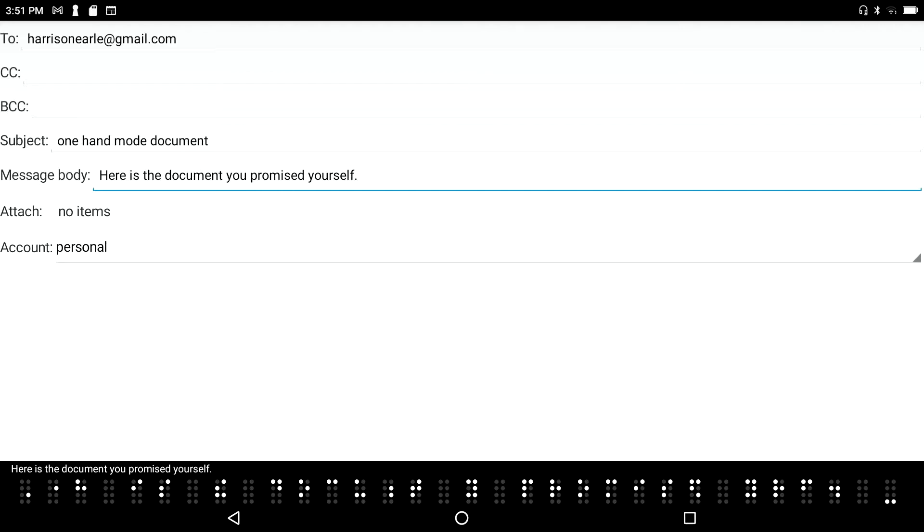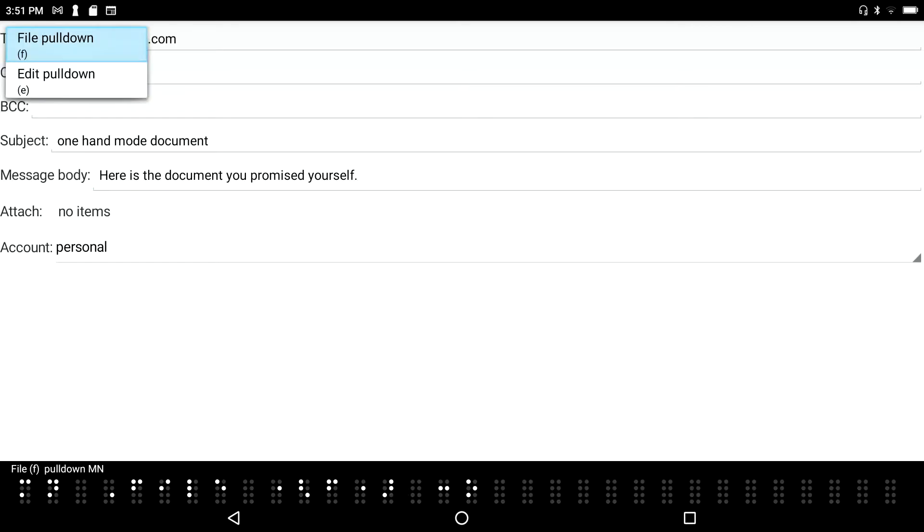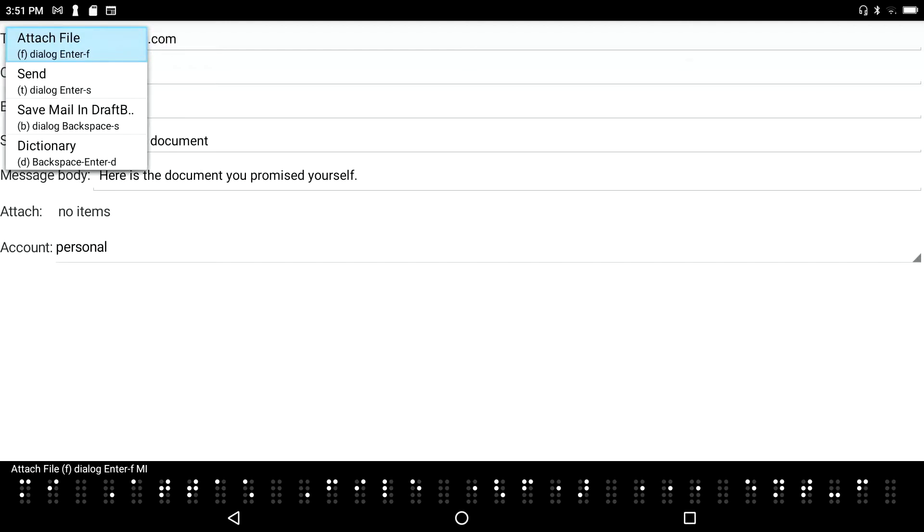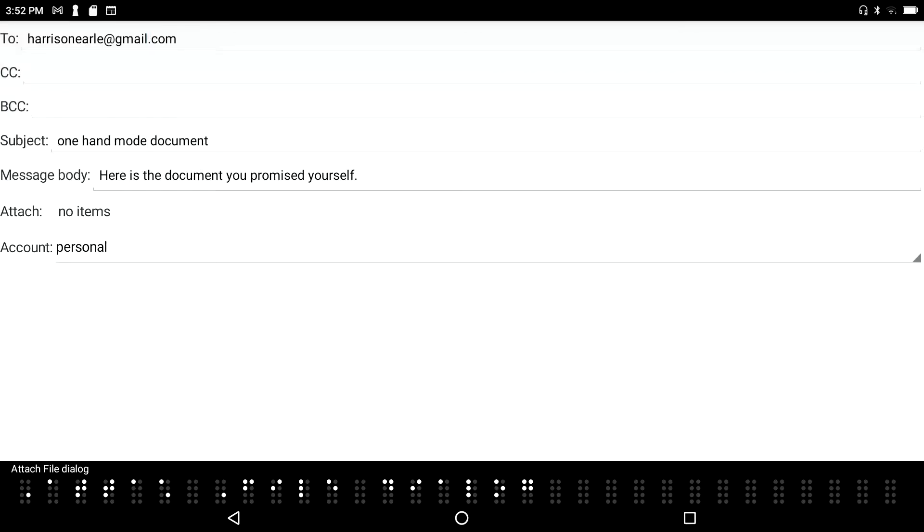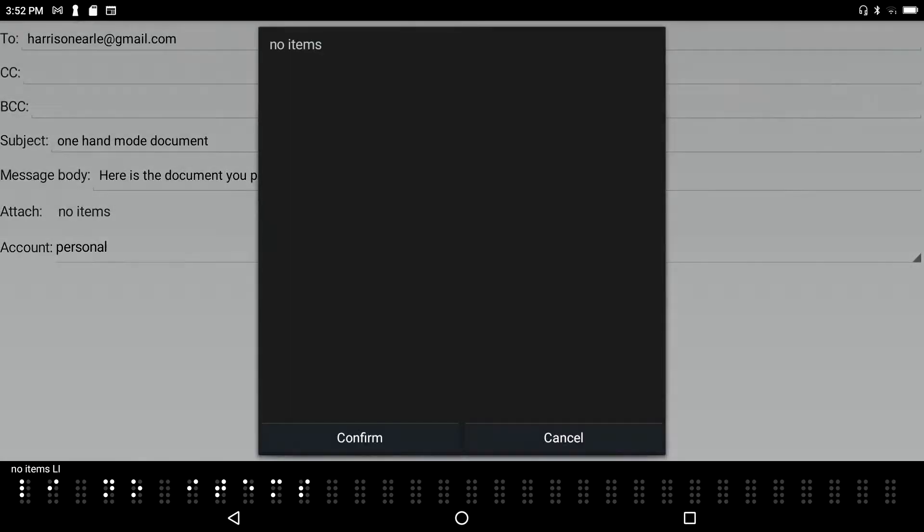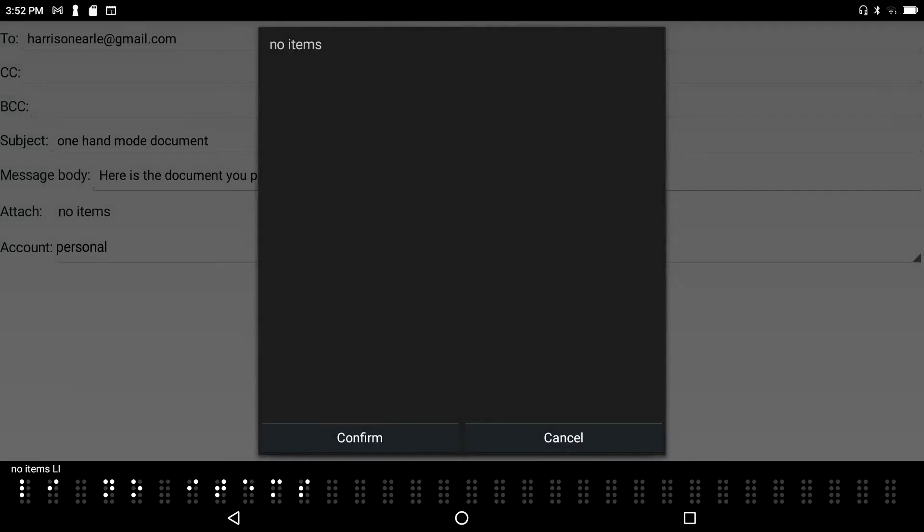And now I'm going to press F2 because, remember, that's the key to get into the menu system for the application I'm in. File F, pull down menu. Which, of course, is the email client. I'll press enter on the file pull down menu and the very first option is to attach a file so I'll go ahead and do that.